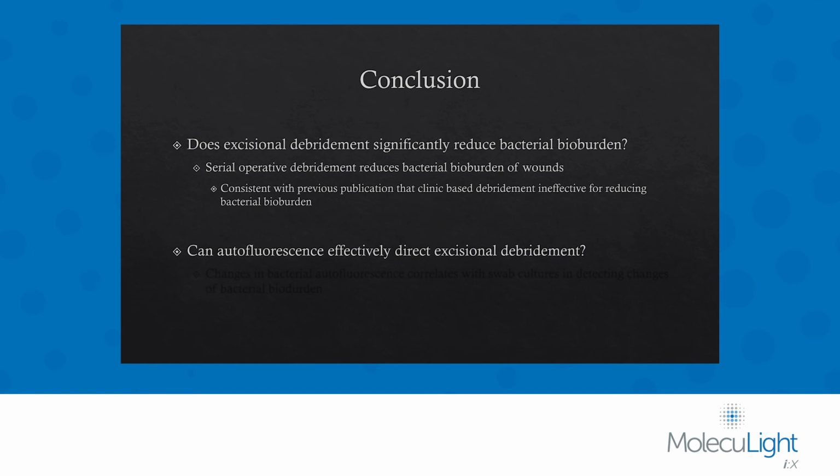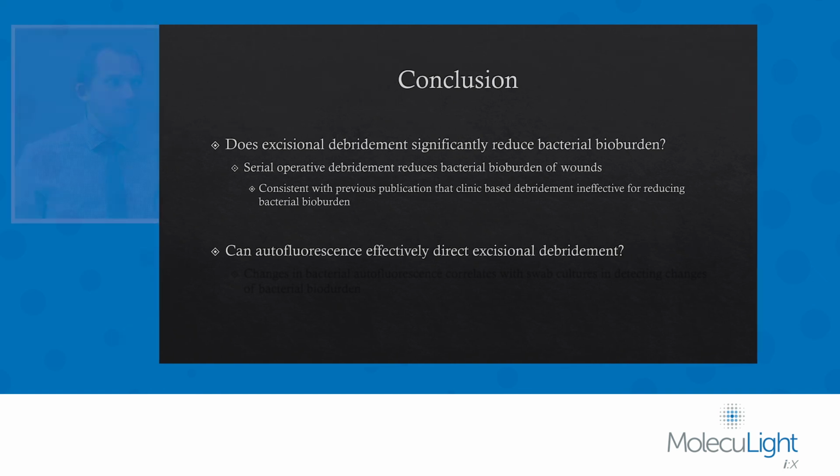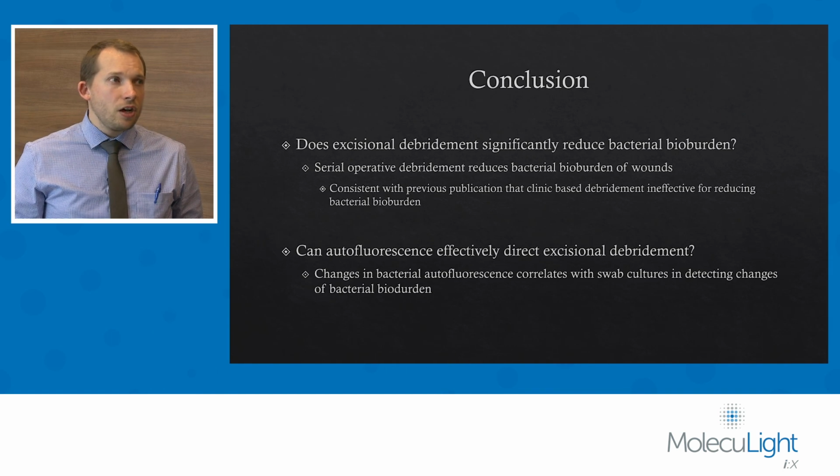And second, can autofluorescence effectively direct excisional debridement? Yes, changes in bacterial autofluorescence correlates with swab cultures in detecting these changes of bacterial bioburden.